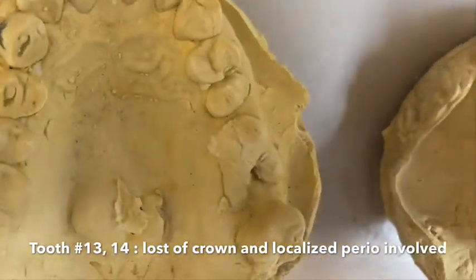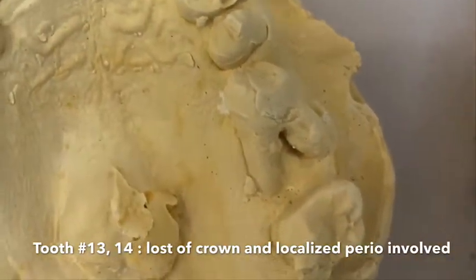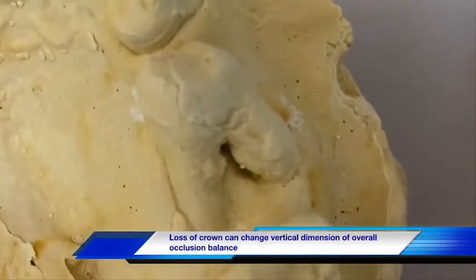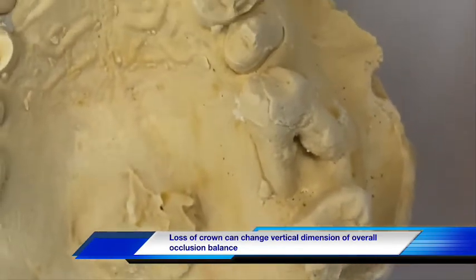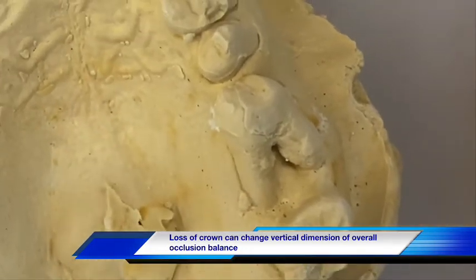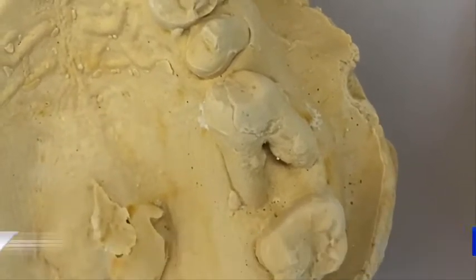Number 13, he lost the crown for a long time and never came back to any dentist to restore it. That lost the vertical dimension, the same way at tooth number 14. Looks like he also lost another crown, and he also has periodontal disease with advanced bone loss on that tooth as well.